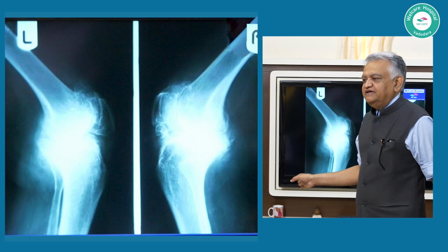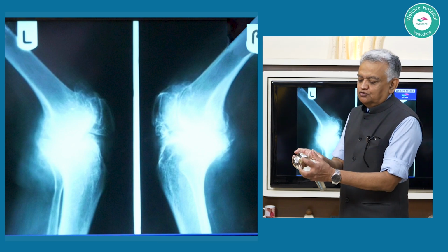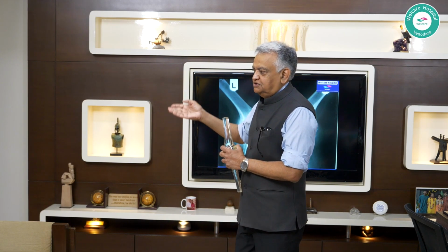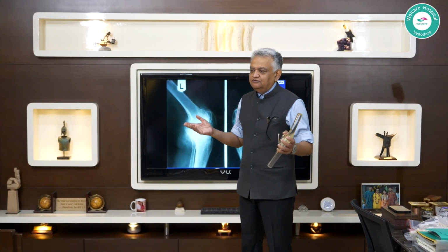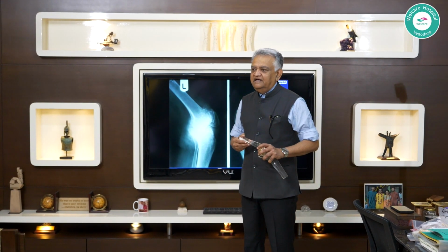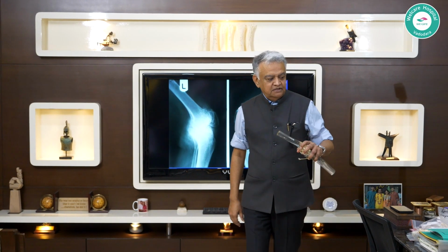As such, the act of knee replacement is that you take away the contours that were given by God or disease, and you put a contour which was made by man. And that is the whole point I make when I say, what the hell are you talking about wanting to get an exact alignment, etc. As such, you are doing an adaptive exercise. It is a modification exercise. It is not a recreative exercise of bringing back normal biology that existed before. So it's stupid, but then that is what bright brains and eager business end up doing when they get together.